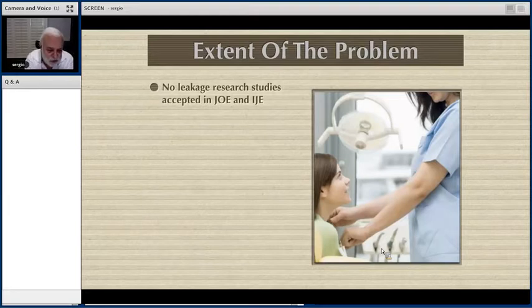That was a technique designed by Dr. Pashley and modified by Dr. Wu. And the material that we used did not leak at all. My God, what a great material, we thought. And then we took exactly the same teeth, not different teeth, exactly the same teeth, and we put them in a filtration on a centrifuge with India ink. And oh my God, all those canals were leaking all the way from the apex to the entrance of the canal. And they were the same teeth. So different methodologies, different results.